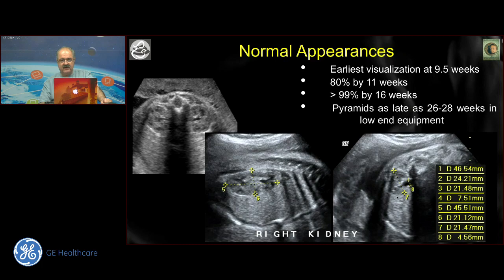The overall measurement of kidney size is done more as a matter of routine for comparison later on in case you find an abnormality, when you have a doubt on whether a kidney is hypoplastic or not, or in case you see an abnormal kidney such as an echogenic kidney. We know that the differential diagnosis of a small echogenic kidney is quite different from that of a large echogenic kidney. And remember that although it is traditional for many of us in radiology to just measure the length and the width, it is wise to also measure the thickness of the kidney in an axial view so that you have an anteroposterior diameter as well. So the kidney should have a mention of 3 dimensions and an AP diameter of the renal pelvis.